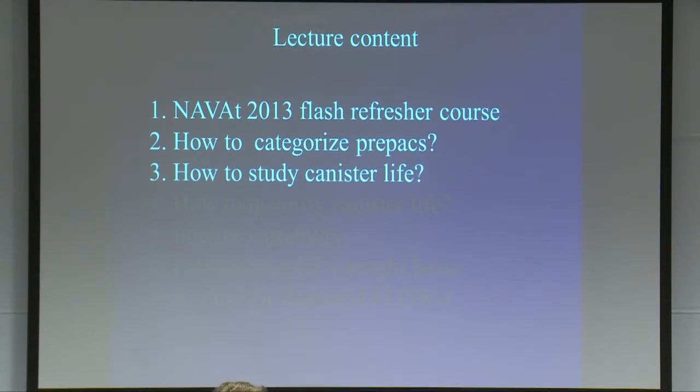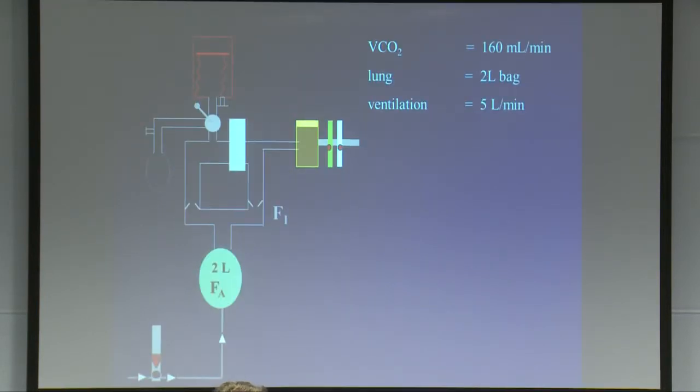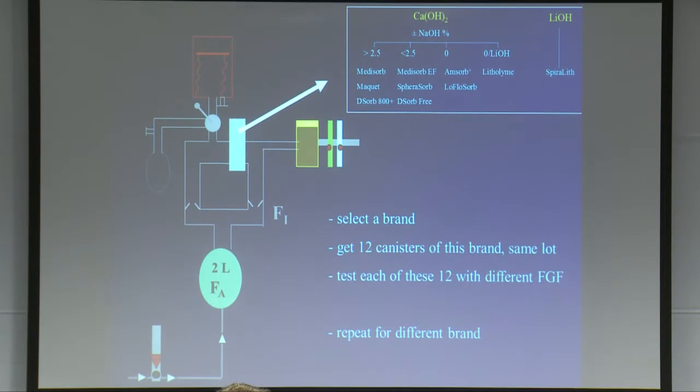Now, how to study canister life? Well, this is the experimental setup I've been using over the last few years. And again, we have our circular breathing system, and I'm feeding 160 milliliters of CO2 into the tip of this balloon that is simulating the lungs, a 2-liter bag. And I am ventilating this bag with a 5 liter per minute ventilation. Then I pick my choice. I'm going to select the brand, for example, Medisorb.